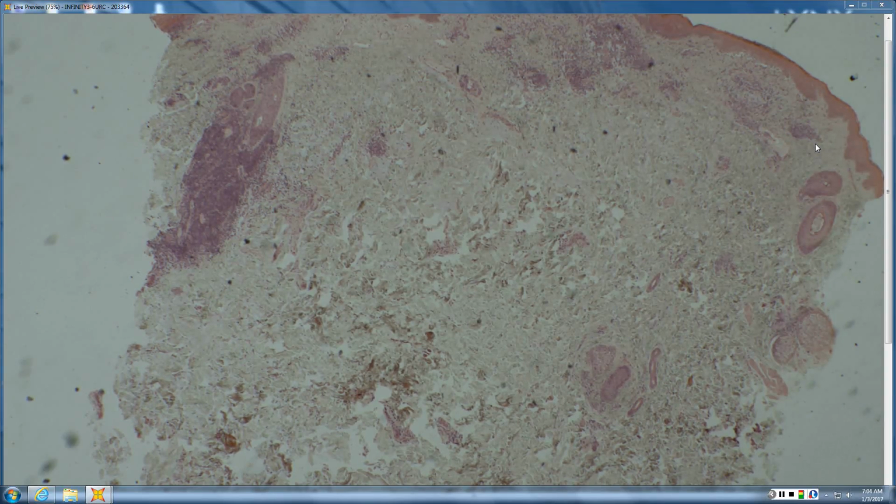But with lupus, the inflammation is largely at the isthmus level of the hair follicle, and you don't really see the whole hair follicle here. But if you can imagine this long hair follicle that's coming down, if it's predominantly located around the infundibular portion, that's where you're seeing the inflammation, maybe the scarring and the damage, then that points towards lichen planopilaris. But if it's predominantly the isthmus location, so a little bit further down, then that goes a little bit more with lupus.